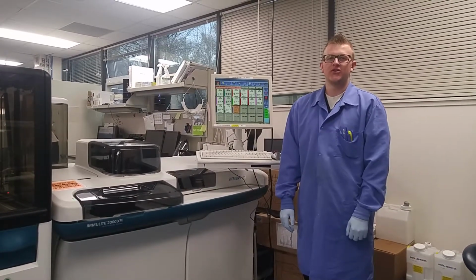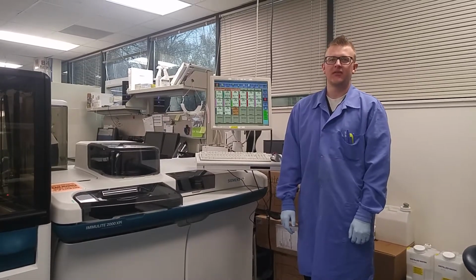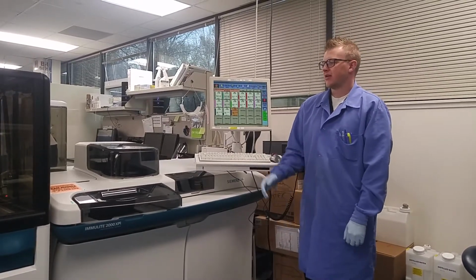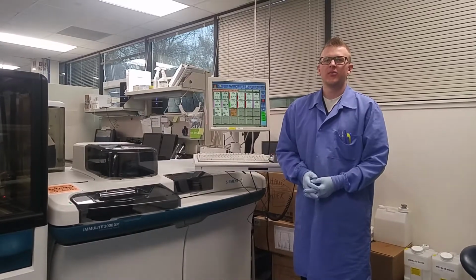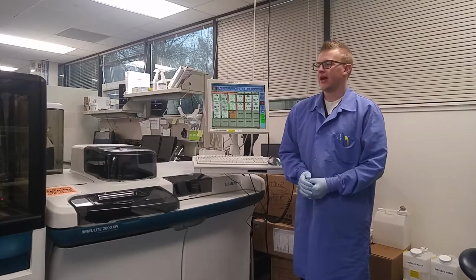I'm going to show you how to troubleshoot a Clot error on the Siemens Immulite 2000 XPi platform. At the conclusion of this training video, you will be able to effectively troubleshoot any Clot this platform encounters.